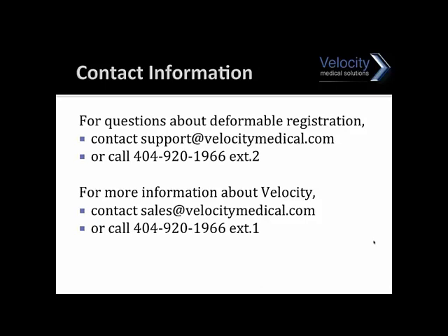Another was, is the deformable registration and QA presented specific to Velocity software? That's a great question. There are a few different commercial products that do deformable registration, and there are others as well that do QA. Most of them may have some tools or others. Some have the point-to-point. Others may have the grid lines. So depending on which deformable software you go with, that can determine which tools you have in the system.